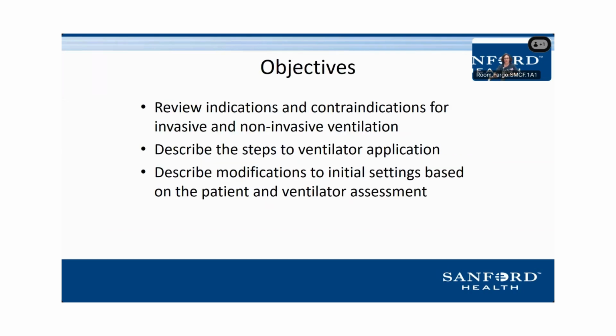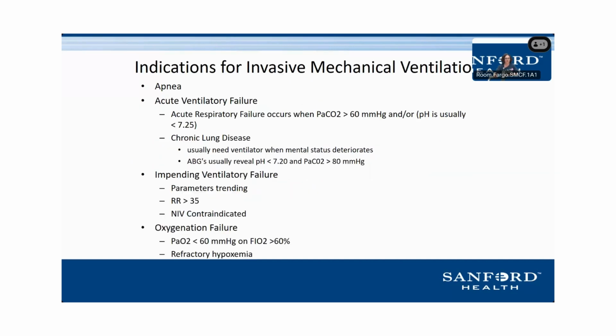We're going to talk about indications briefly of invasive and non-invasive ventilation and talk about getting that ventilator set up, getting some initial settings on the machine, and taking a look at how your patient looks on those initial settings.